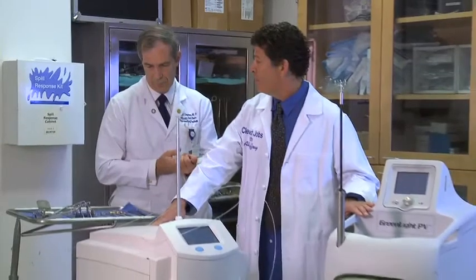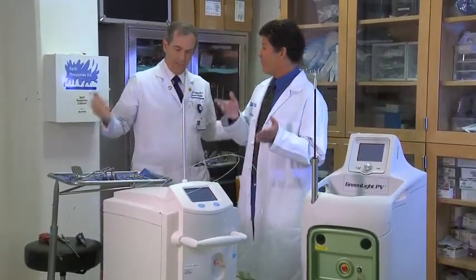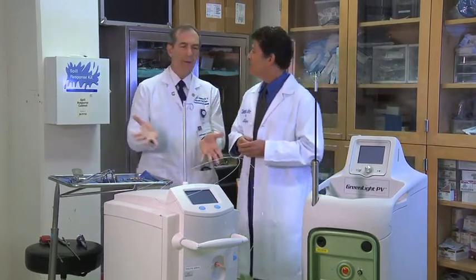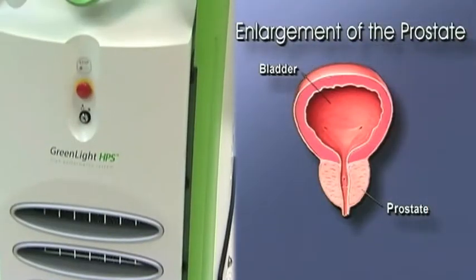So tell me about these two, and then tell me about this thing I've heard, the Da Vinci. Okay. We're actually going to go from here to talking to Dr. Allering about the Da Vinci robot. Right. But tell us about what these do. These are lasers, and the laser on your left is called a green light laser. It is used at our place to take care of prostate surgery in the case where it's non-cancerous and it's causing blockage, so you can't empty your bladder.